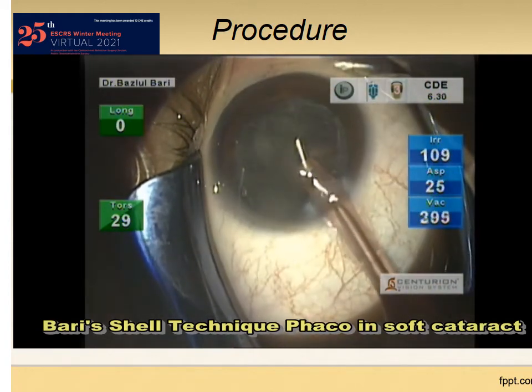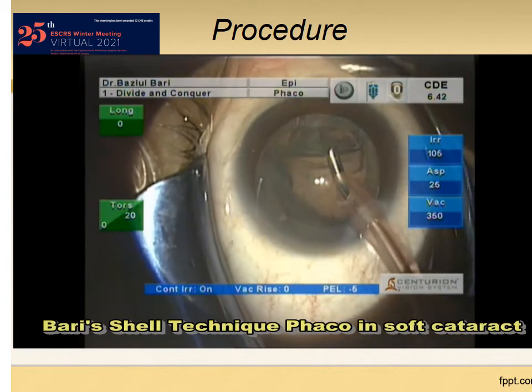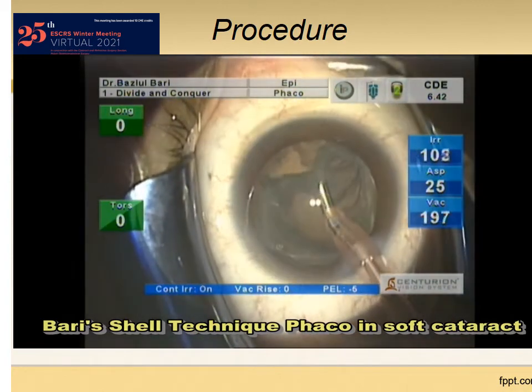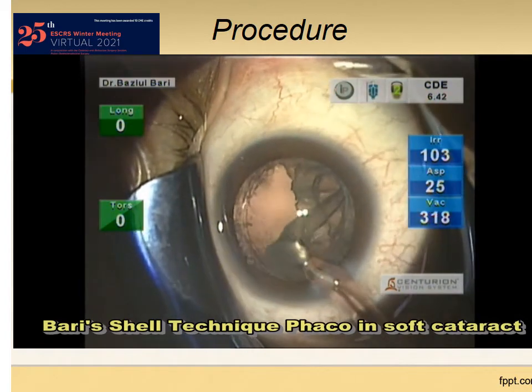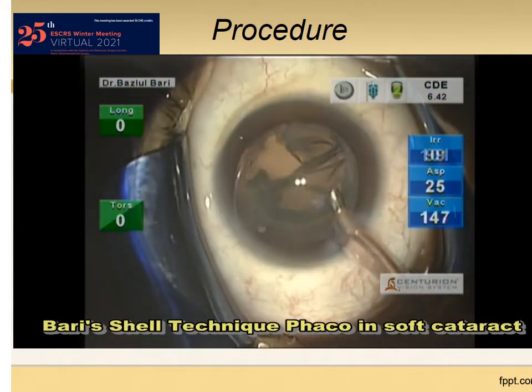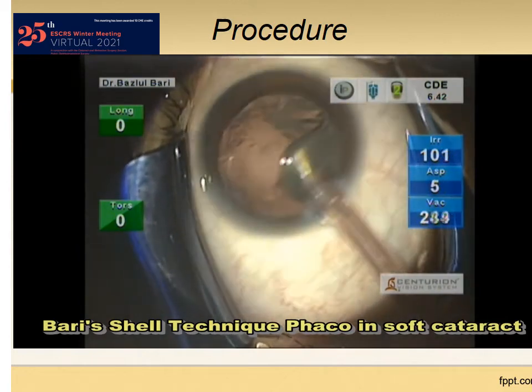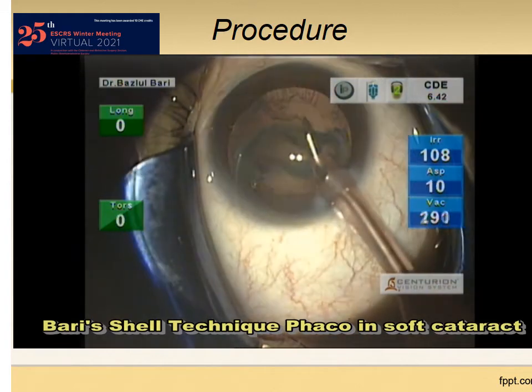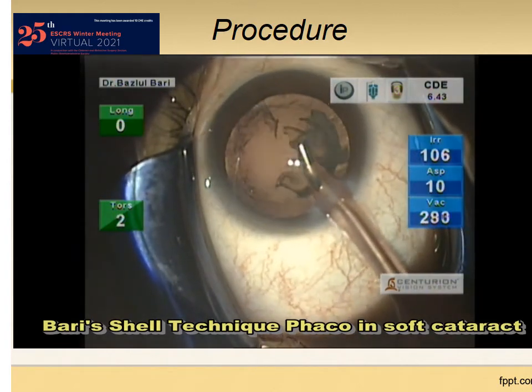Now, removal of the shell. I prefer to remove the shell with the FACO tip directly. You can also use the irrigation-aspiration tip of the FACO machine or even a cannula. The remaining part of the surgery is as usual — cortical cleaning and intraocular lens implantation.